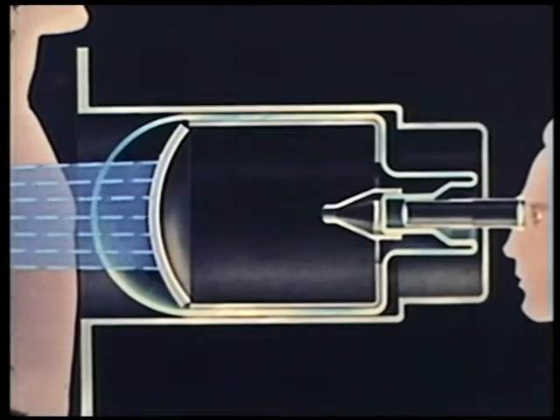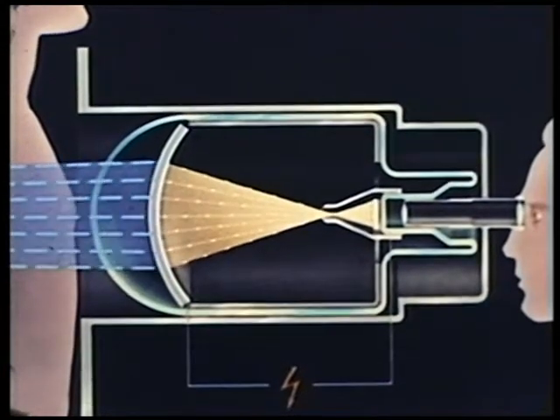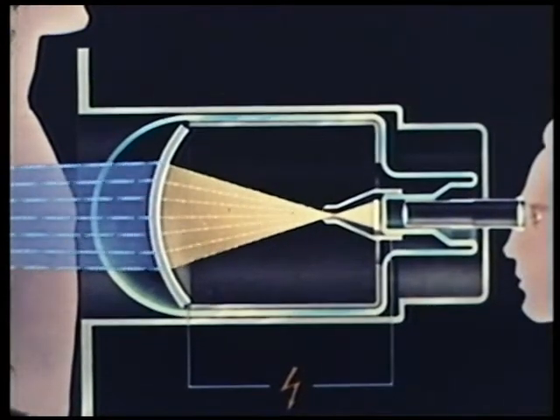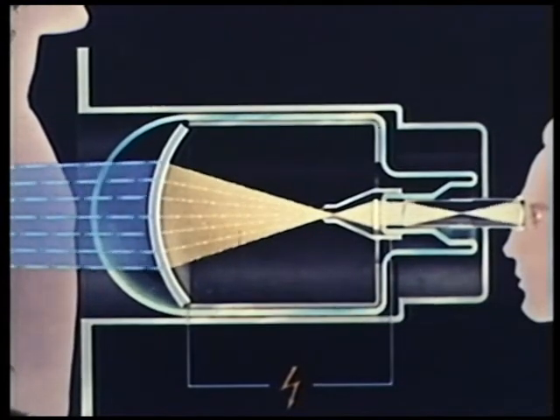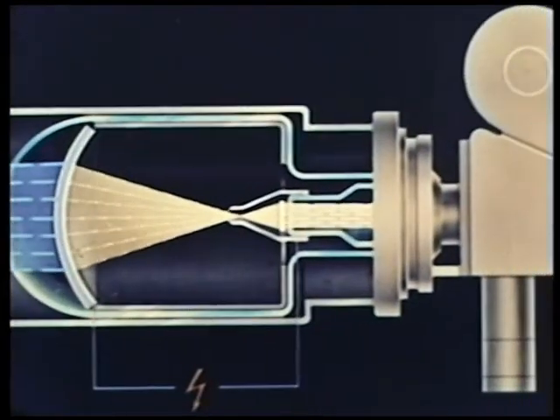If a high voltage electric current is passed between anode and cathode, the electrons are speeded up in the direction of the observation screen. As a result of electrostatic projection onto this screen, an image is seen, the light density of which is increased 800 to 1,000-fold. This bright, reduced picture is observed through a telescope. Instead of using this optical apparatus, single-shot photographs or cinefilms can be taken.